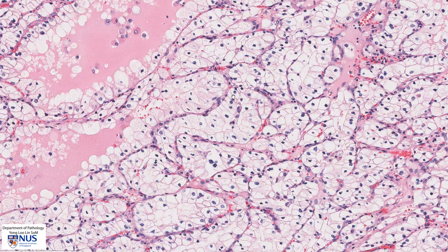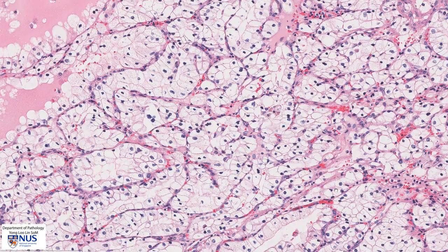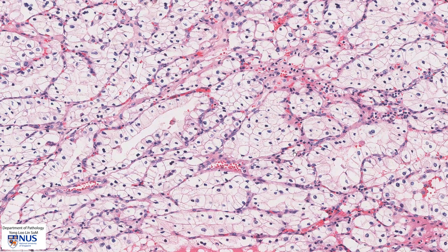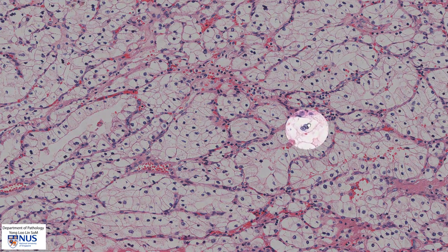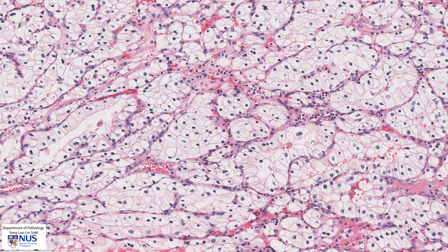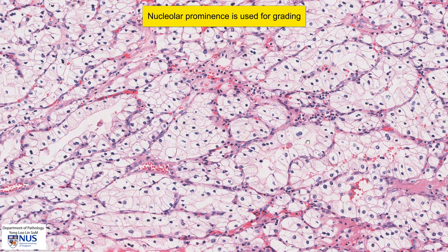Let's focus now on the nuclei of the tumor cells. We can see that they are relatively small and uniform in size; the cells have low nucleocytoplasmic ratios or low NC ratios. And over here, some of the cells contain quite distinct nucleoli. Noticing the nucleoli is important because this is part of the grading process of renal cell carcinoma — specifically, how clearly can we see the nucleoli at certain magnifications.